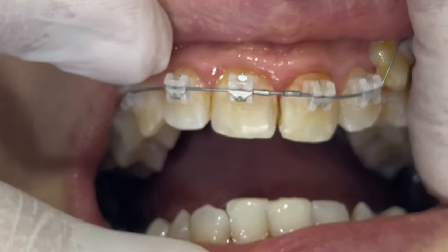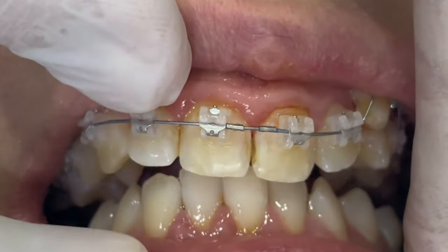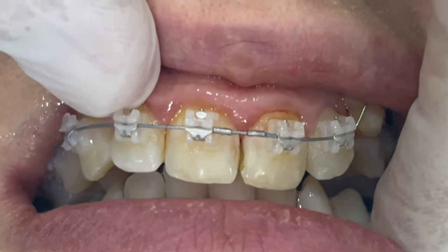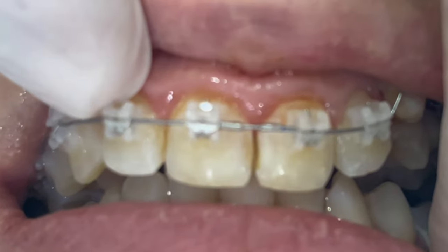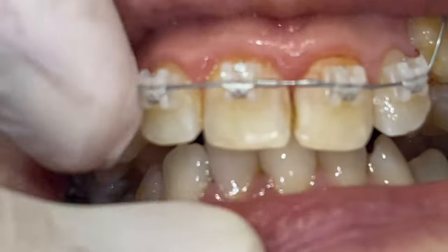In the patient, you will see that we now have some vertical space to start bonding and leveling the lower teeth. The other option is to wait until we have good leveling of the upper teeth.